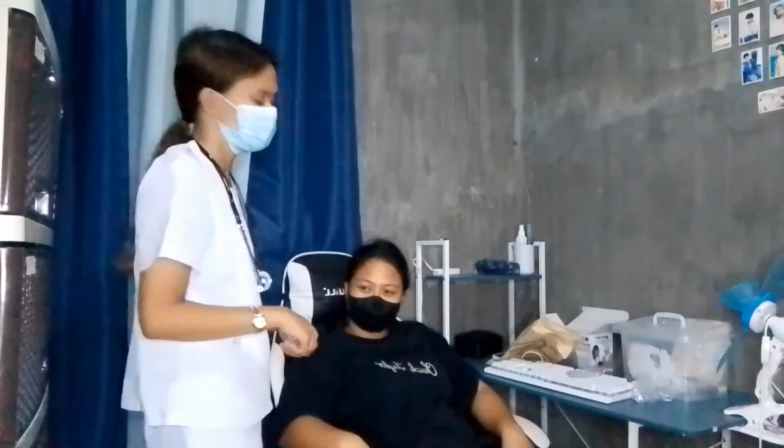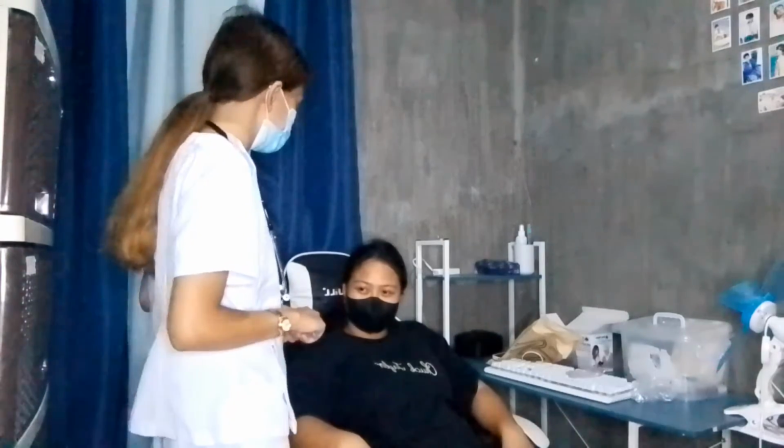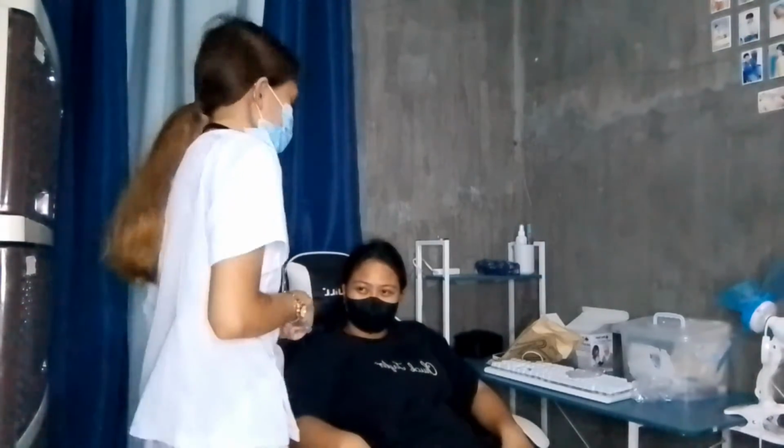Provide for client privacy. Place the client in the appropriate position. For the temperature, clean the thermometer. Place the thermometer at the appropriate route or site.